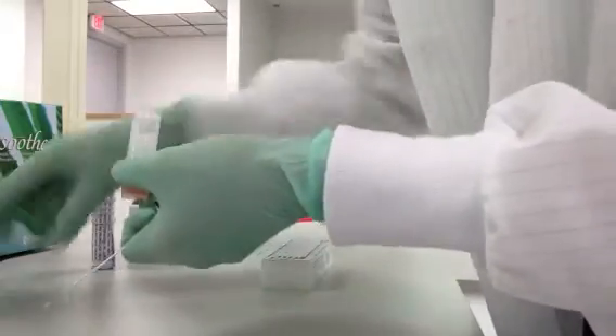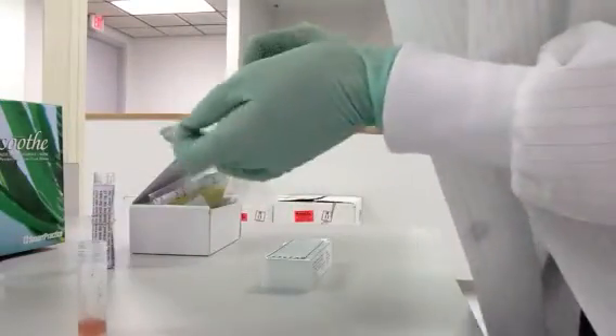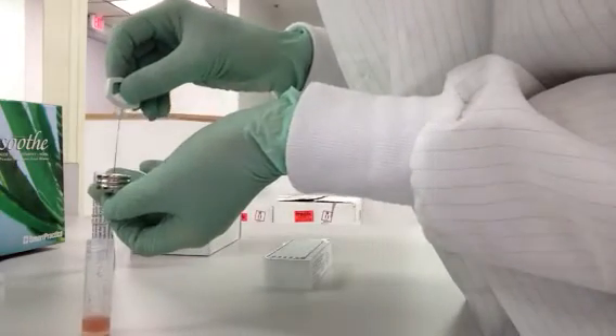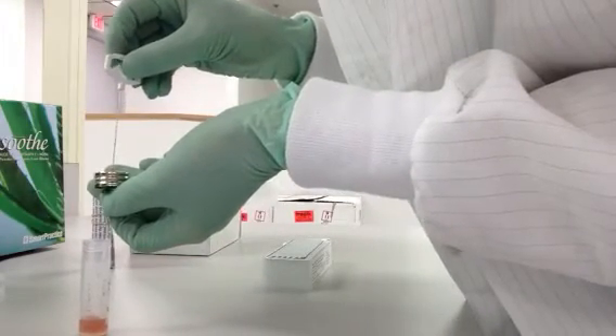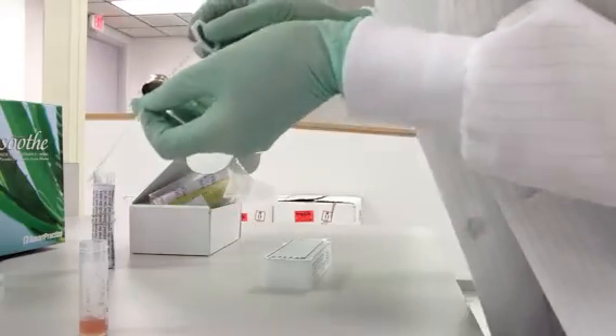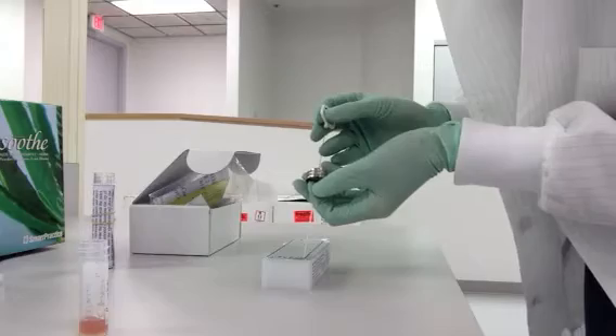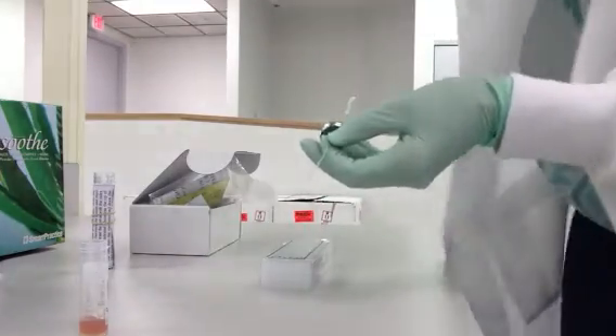From there, just like a syringe, you draw the sample into the tube itself up to that line. So once the sample is in there, then you just put it into the appropriate well, and you're ready to run the VaxiCheck.